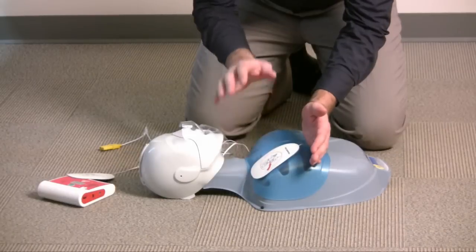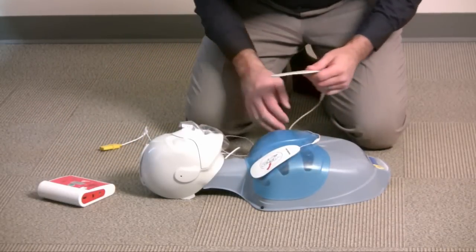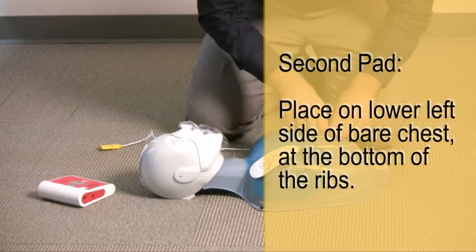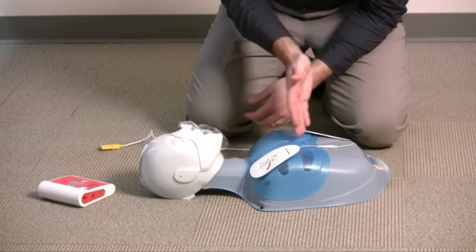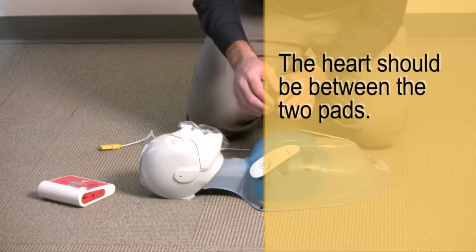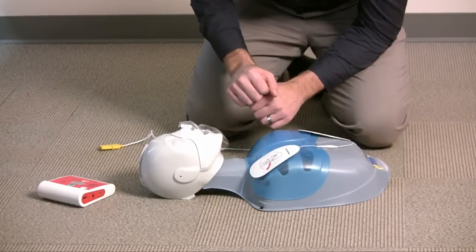So the first pad I'm going to put on the upper right portion of the chest cavity from the armpit line and above, and we need to make sure we're on bare skin here. The second pad is going to be placed just at the bottom of the rib cage on the lower left portion of the chest. And again, tracing a line from the pads, the heart should be right placed in between. Now, once the pads are in place, we just simply need to turn the machine on and listen to the instructions.